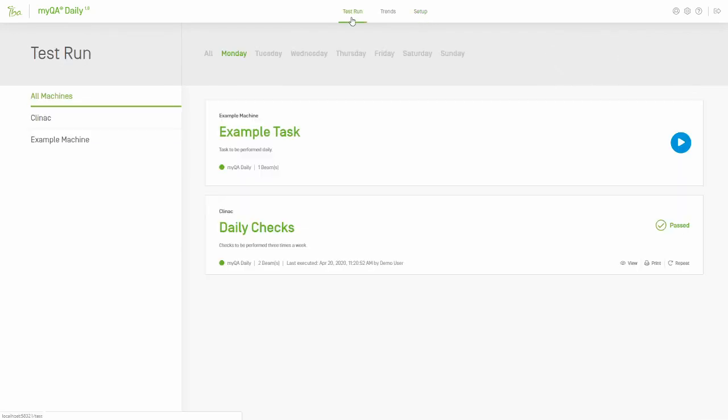The tasks which are due to be run are displayed alongside the name of the machine associated with that task. Initially, all tasks which are due will be displayed, but it's possible to see only the tasks associated with a single machine by selecting it from the list on the left.